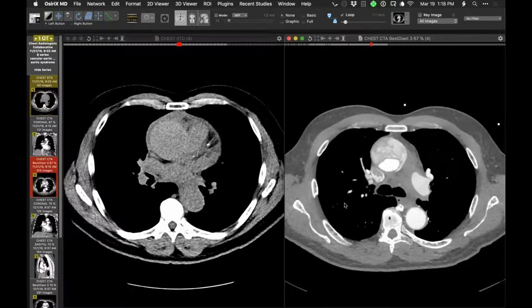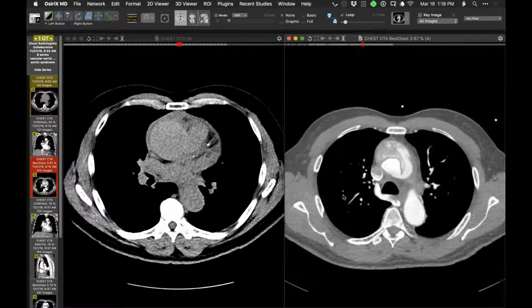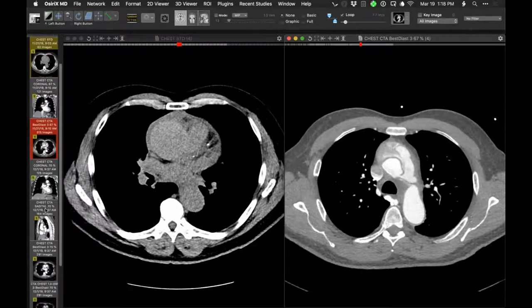But I think the important thing about this one is that this patient is very amenable to, number one, fixing the ascending aorta in the usual fashion with surgery. But given this location of this breach in the distal aortic arch, for those surgeons that now do the so-called frozen elephant trunk technique, at the time of surgery, put in that frozen elephant trunk, that stent, to cover this particular defect. So the patient is a great candidate for the simultaneous surgery to take care of the ascending aorta, aortic arch, and a frozen elephant trunk.